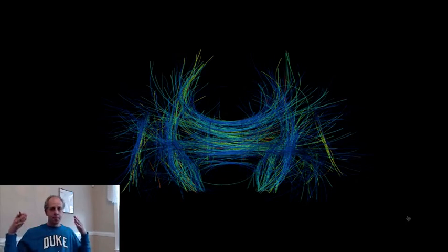So to recap, you go into the magnet, you get these magnetic fields in different directions, you compute the probability of having a cable or a fiber in a given direction, and when you want to get information about 2 points, you use the Hough transform to do a voting process, and you can get that connection. And this is not the only way to do that, it's just one way, and I think it's a nice way to illustrate how some tools that were developed for image segmentation basically are also applicable in this new modality.